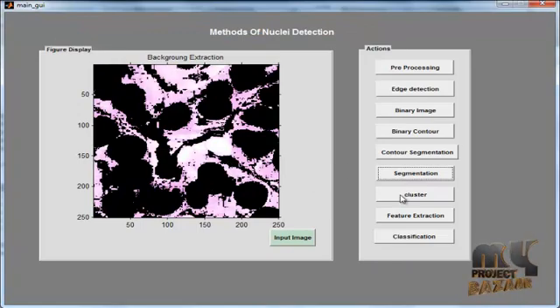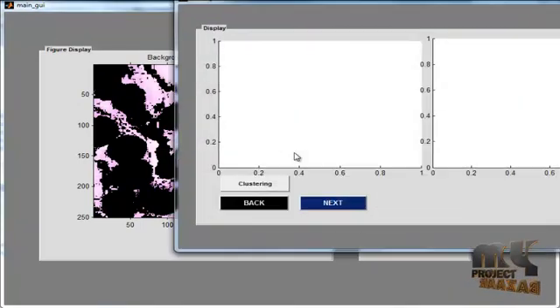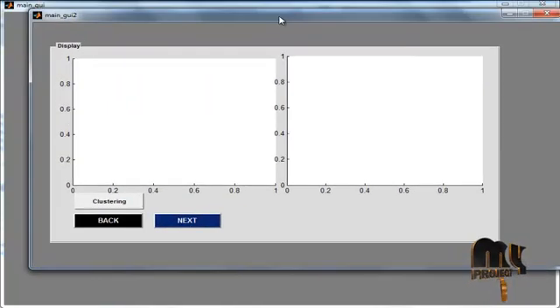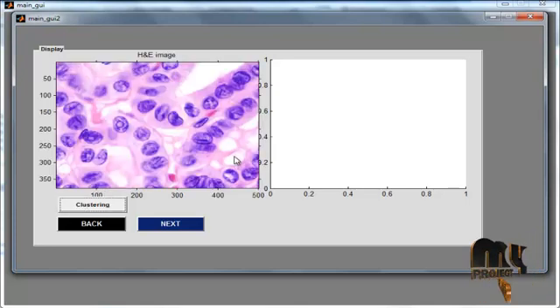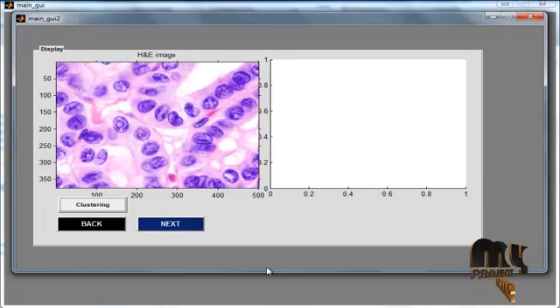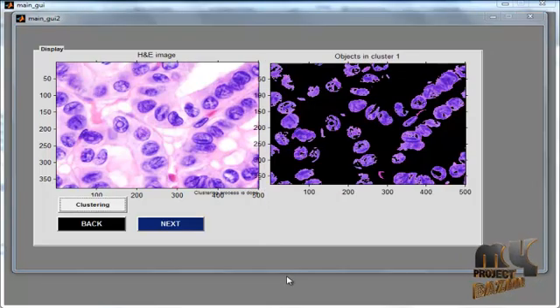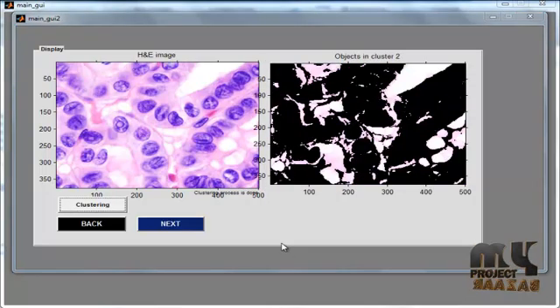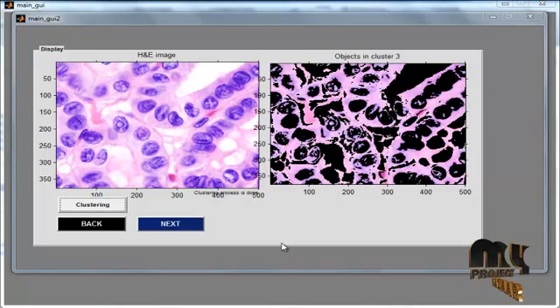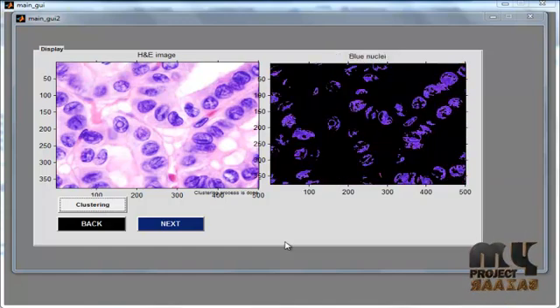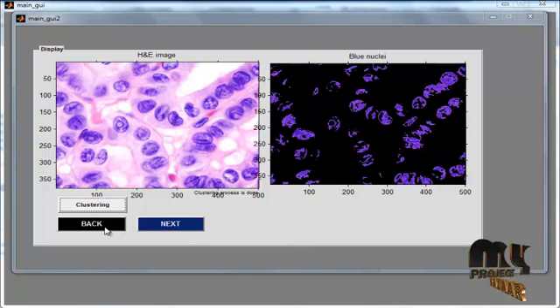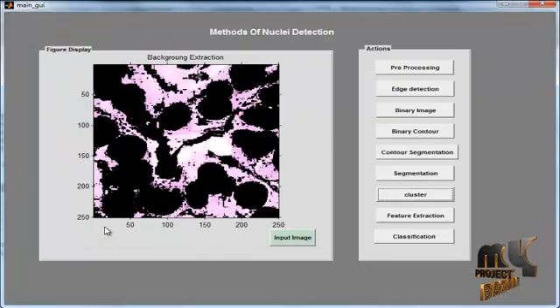Now click the Cluster button. After clicking it, another GUI window opens. The image is clustered into three types: first, clustering based on the nucleus color, and then two different clusterings for the background. Then click the button Back.